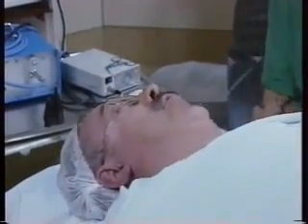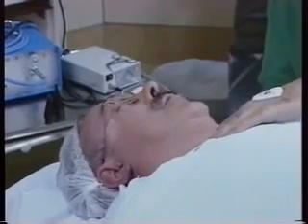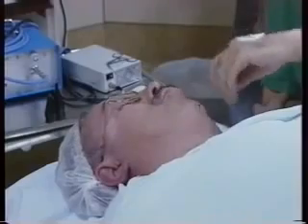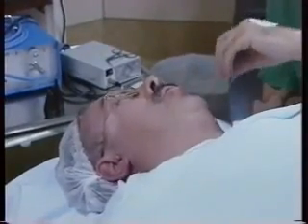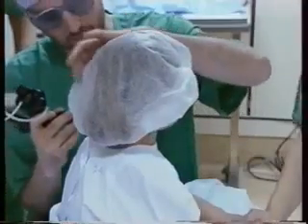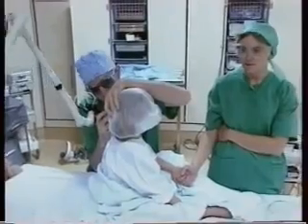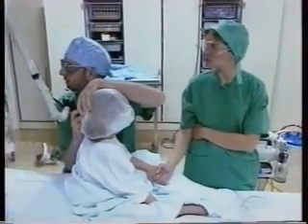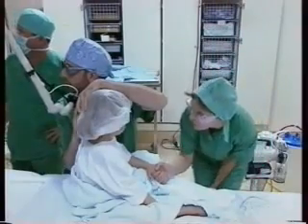Office-based CO2 laser-assisted tympanostomy, performed under local anesthesia, provides middle ear ventilation for several weeks without the insertion of a foreign body in the eardrum. We used it to treat patients with chronic OME that persisted for more than 3 months despite conservative treatment, medication and/or physiotherapy. We did not associate any other treatment, systemic or topical, to the CO2 laser-assisted tympanic membrane fenestration.